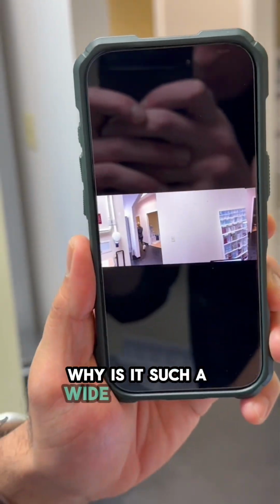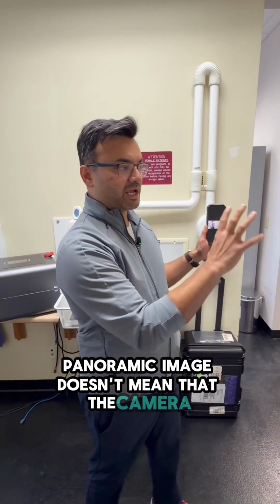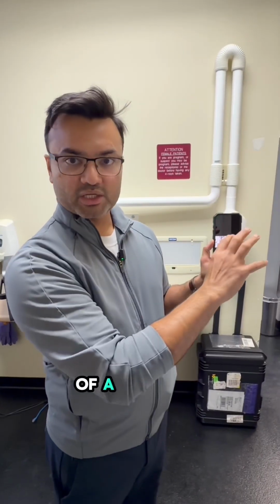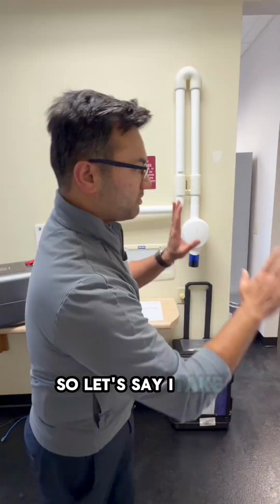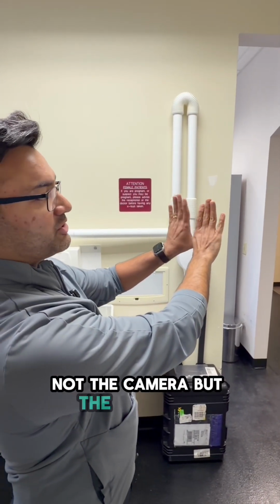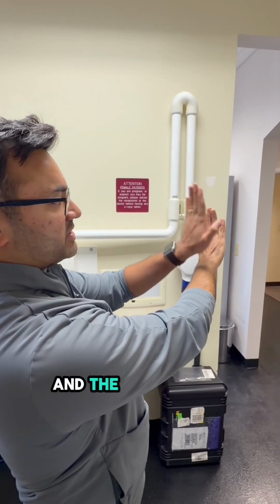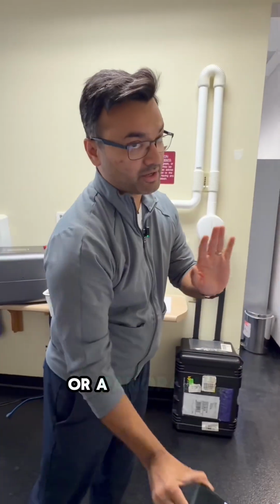Why is it such a wide frame of a picture? A panoramic image doesn't mean that the camera actually really took an extremely wide image. What it really did is that it took a video series of a bunch of pictures together. So let's say I take one picture, the video moves on, there's another picture. Not the camera, but the software is identifying half of your first picture and stitching onto your second picture, and the stitch keeps going on. That's how you get a panoramic video or a panoramic picture.